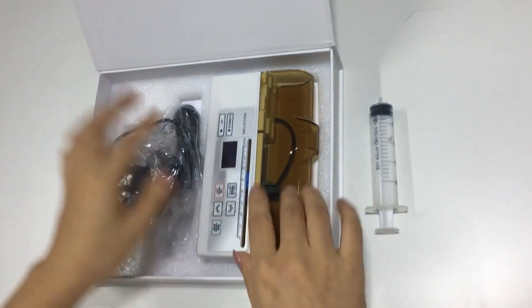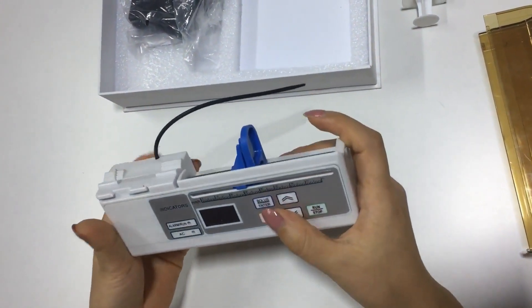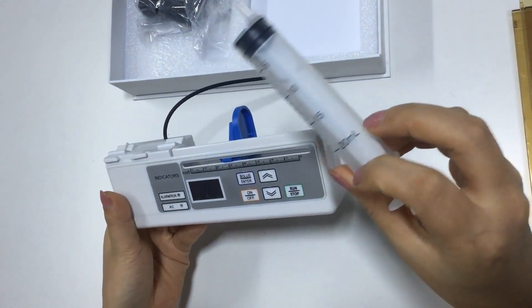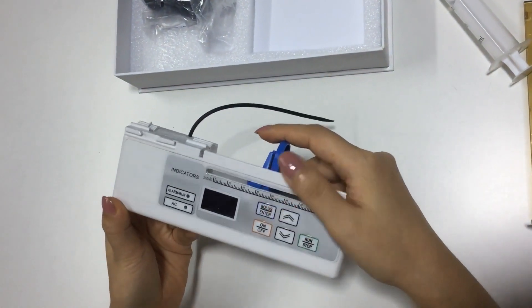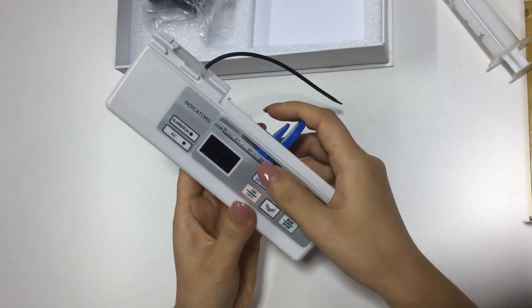First, open the box and take the cover off. The first thing we need to do is calibrate the syringe. This is a 20ml syringe. Connect the two buttons together — the bolus button and the on/off button.